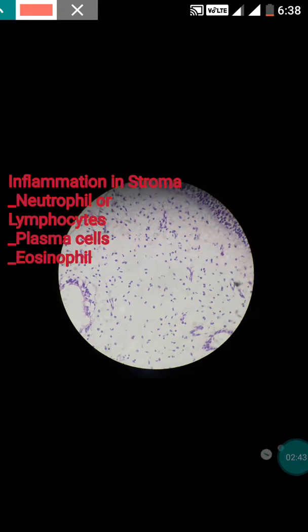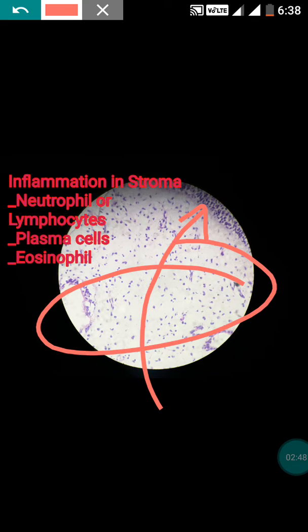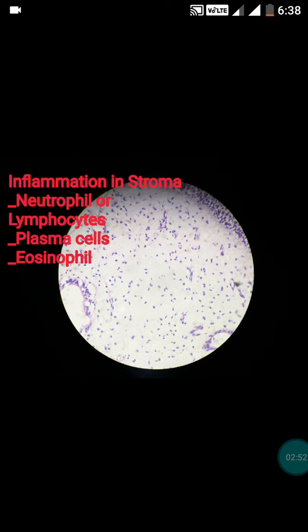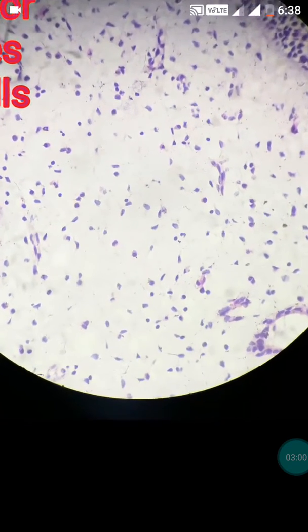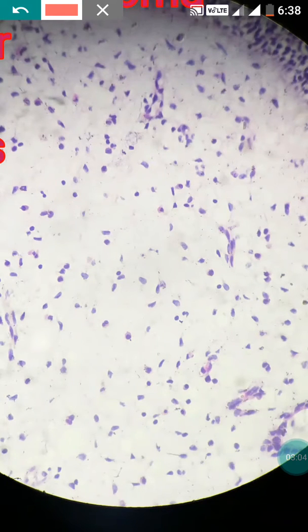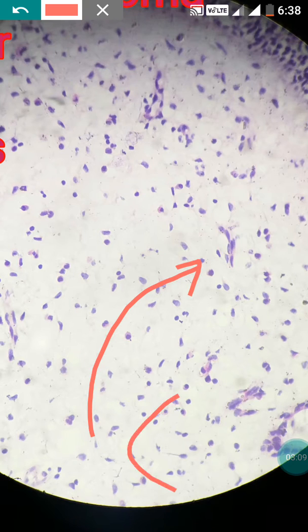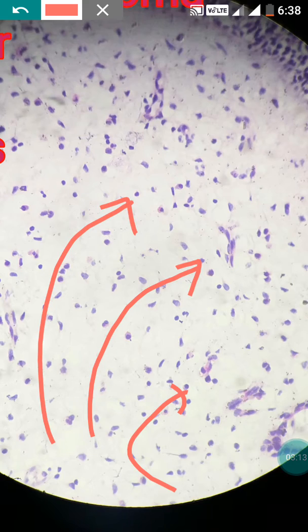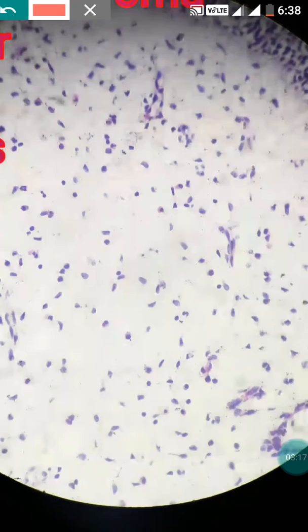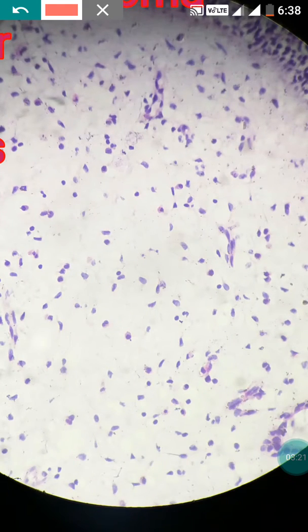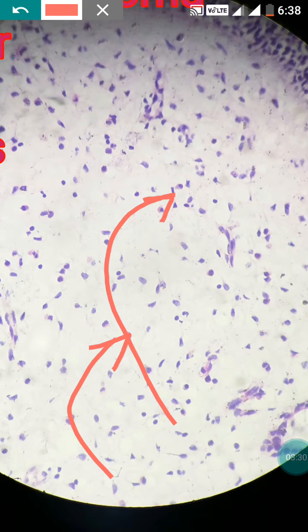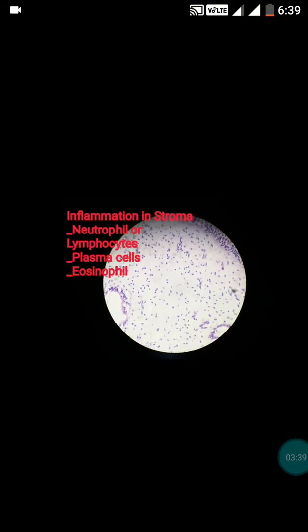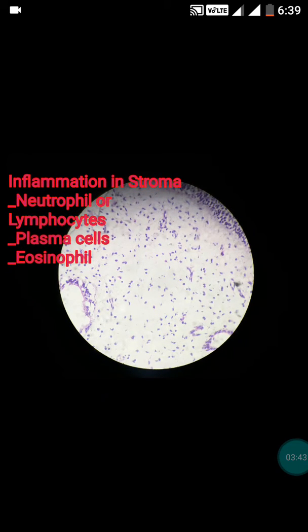In the stroma you can appreciate various inflammatory cells. This is the epithelium, and this is the underlying stroma infiltrated by different inflammatory cells. These are lymphocytes — classical ones, many lymphocytes. In chronic inflammation you can also appreciate plasma cells, which have an eccentric nucleus. This confirms it as a chronic inflammatory nasal polyp.